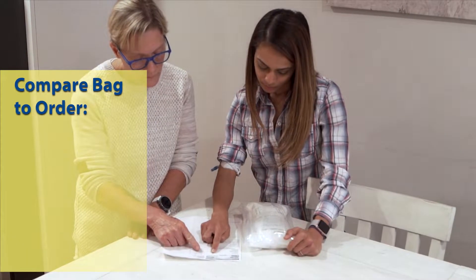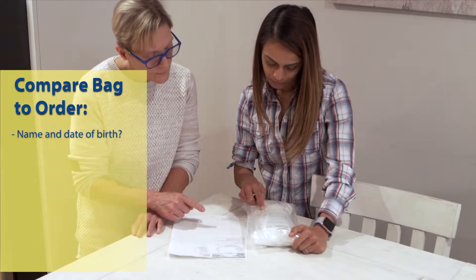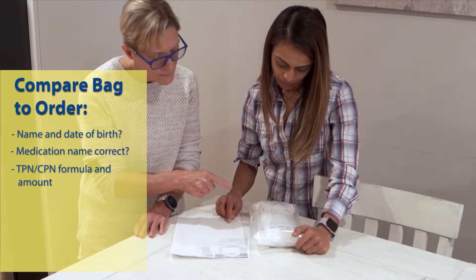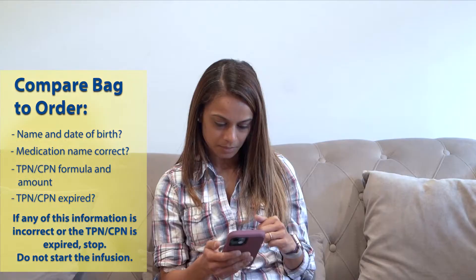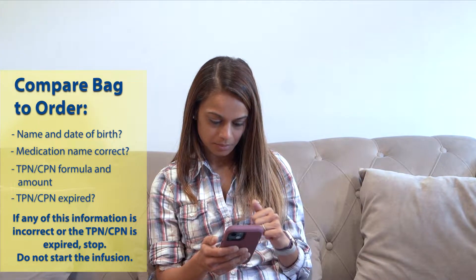Double check your TPN. Compare the information on the bag to your orders and make sure it is the same. Does the TPN have your name and date of birth? Is the medication name correct? Is the TPN formula and amount correct? Is the TPN expired? If any of this information is incorrect or the TPN is expired, stop. Do not start the infusion. Call your home infusion pharmacist immediately.